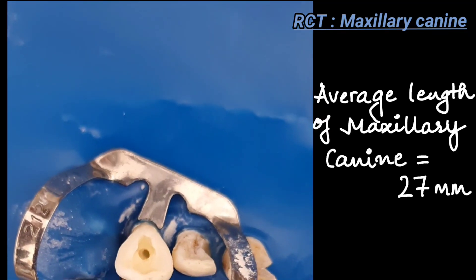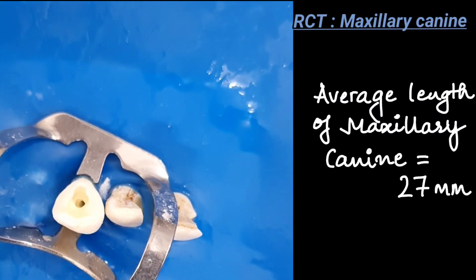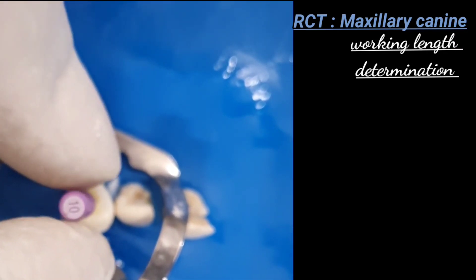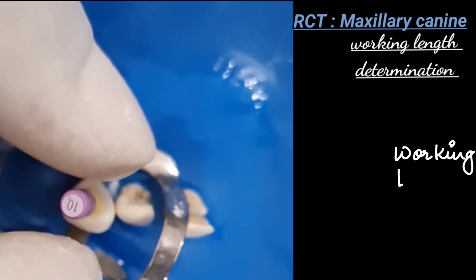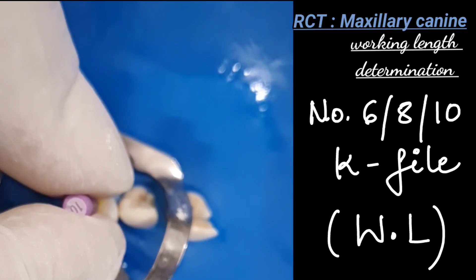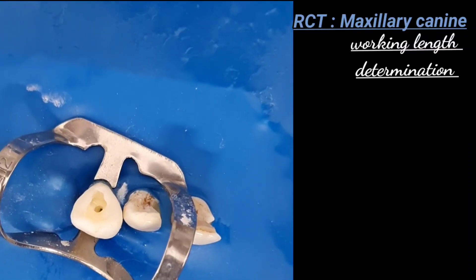Knowledge of the average tooth length prevents trauma or forcing of debris into periradicular tissues. For the maxillary canine, the average length is 27 millimeters. For working length: first, measure the tooth length radiographically; then take a stable occlusal reference point — for anteriors it is the incisal edge, for posteriors it is the cusp tip. The silicone stopper on the file is set to these reference points. In this case, a working length of 23 millimeters was achieved, using a diagnostic instrument such as a number 6, 8, or 10 K-file, which are flexible enough to follow root canal curvatures.